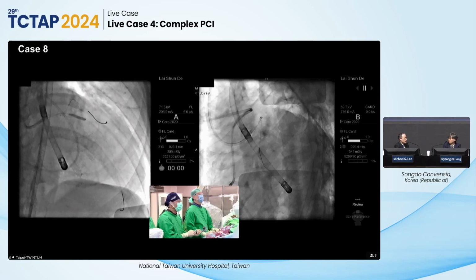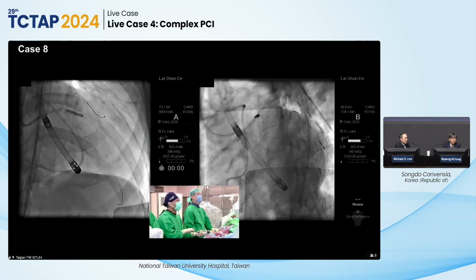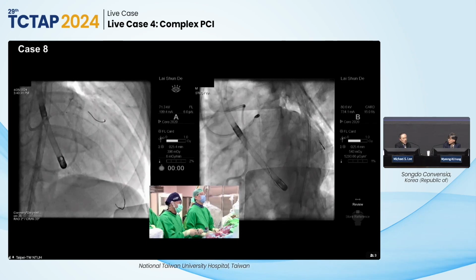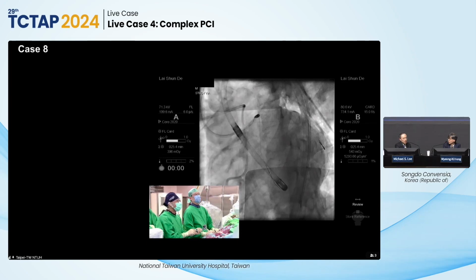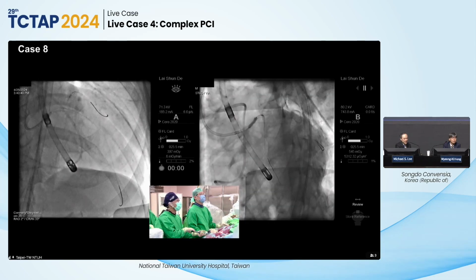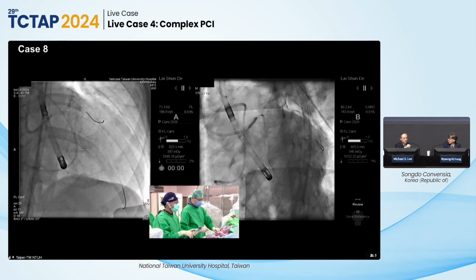If he's still smoking, he's not a candidate for OHT. If he has severe diabetes, he's not going to be a great candidate for OHT. If he's not a candidate, I would revascularize and maybe just address the life-threatening issue, which is the prox LAD left main. After you address the prox LAD left main, I'd give some nitro, see how it lights up. I actually would do an FFR just to see what burden of ischemia is there. If there's a high burden of ischemia and the FFR is low, perhaps I would do maybe a DCB distally.